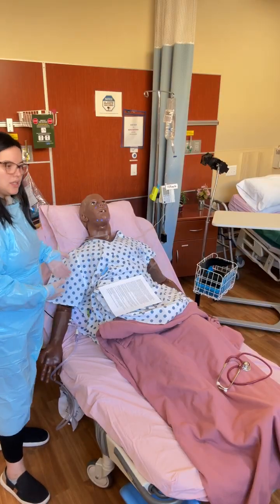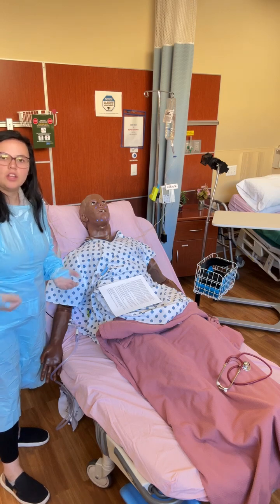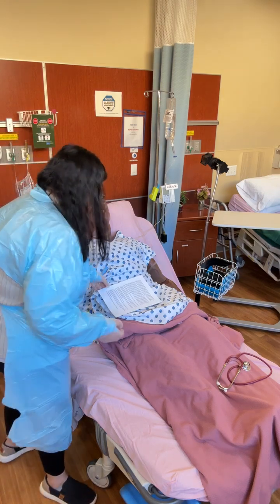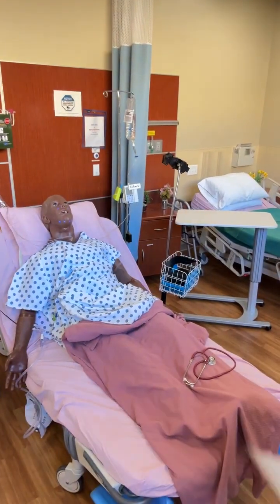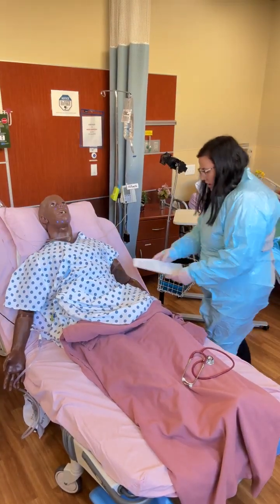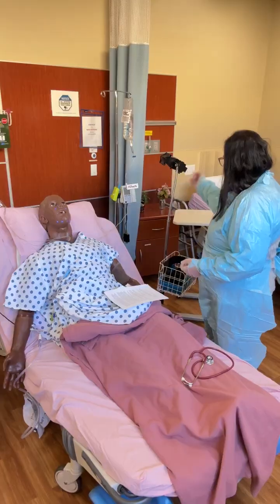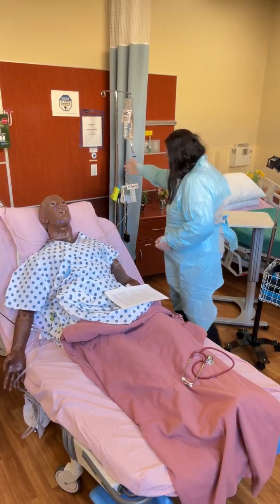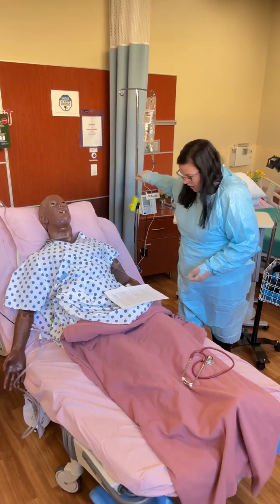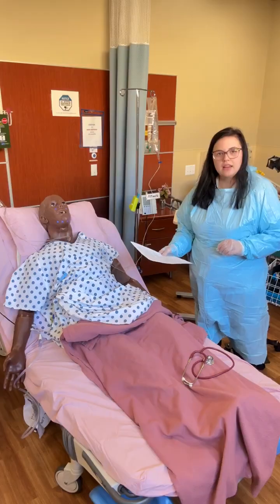You don't want to just go up to the simulator and say, I have an IV here, what does it look like? We want to know what you're looking for, okay? Then once you're done assessing that patient's IV, we're going to have you come right back on over to the other side of the bed so that we can see you. Because we talked about that patient's IV, the IV site is over there, but our IV pump is right here. This is a functioning IV, and you can push fluids and infuse fluids on the IV pump.